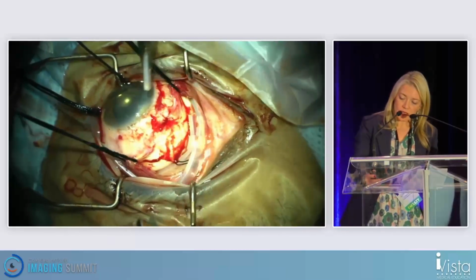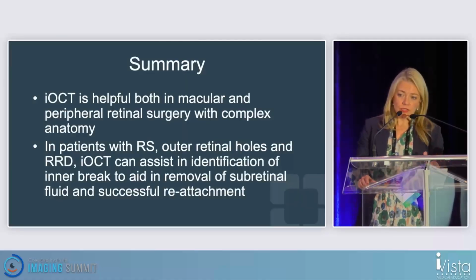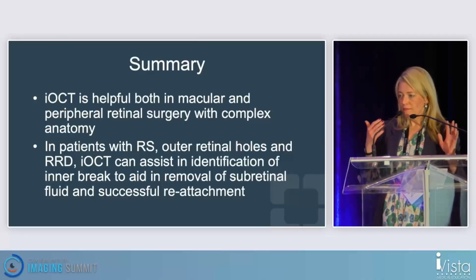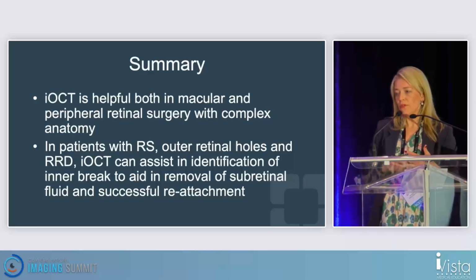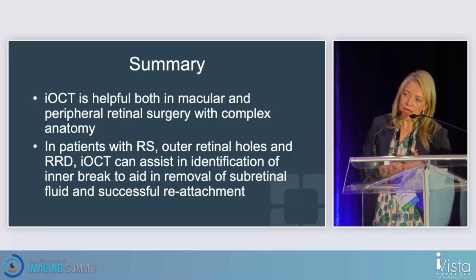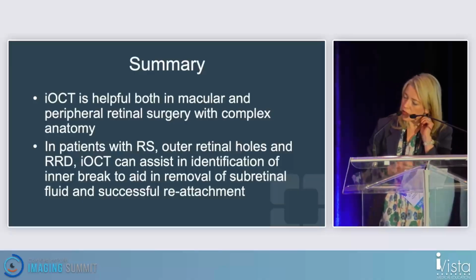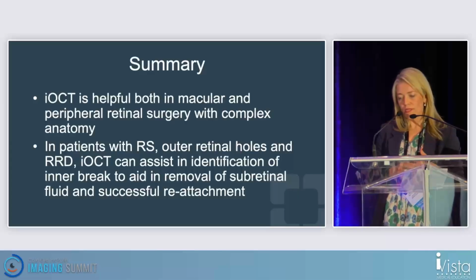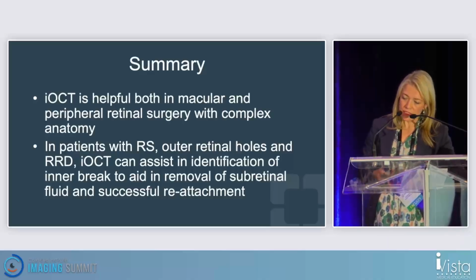And so I think when we look at these cases, I would just encourage you, if you have access to intraoperative OCT, I don't use it in my day-to-day bread and butter cases, but it can definitely be helpful in macular and peripheral pathology when you have this complex anatomy. And I think if we take time with these more challenging cases with retinoschisis, outer retinal holes, and rhegmatogenous components with inner retinal holes, it can really help you find the pathology and lead to successful reattachment.